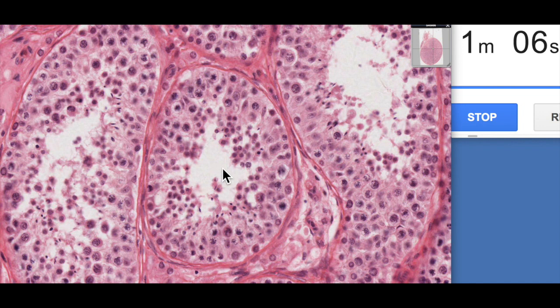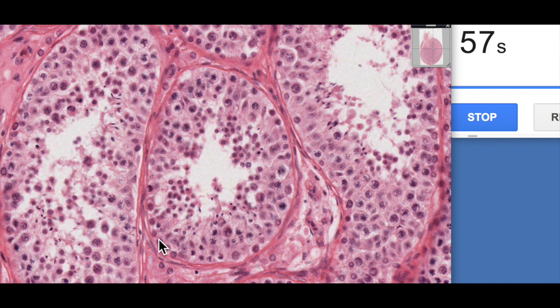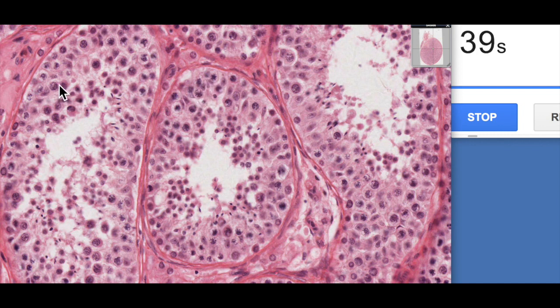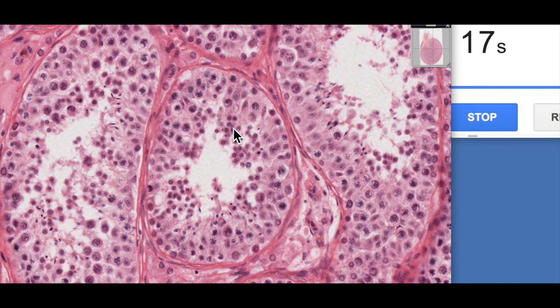Knowing spermatogenesis helps identify the different cell types. The cells on the basement membrane with round nuclei are the spermatogonia — the stem cells that undergo mitosis. One differentiates, enters meiosis I, and becomes a primary spermatocyte — these are the large cells with irregular, weird-looking chromatin. They undergo the first meiotic division to produce two secondary spermatocytes, which immediately enter meiosis II to produce spermatids — the little round cells seen here. These then undergo spermiogenesis to produce mature spermatozoa with very dense nuclei, whose flagella point out into the lumen.